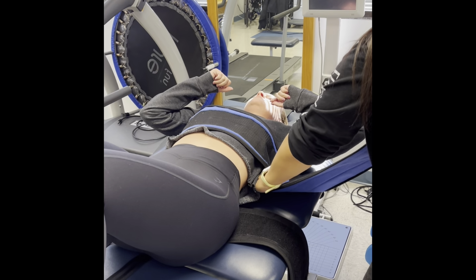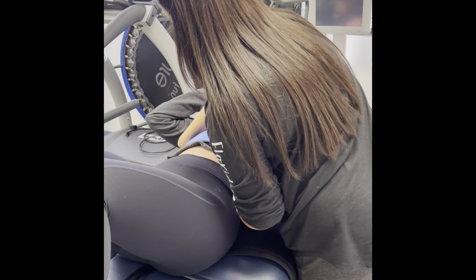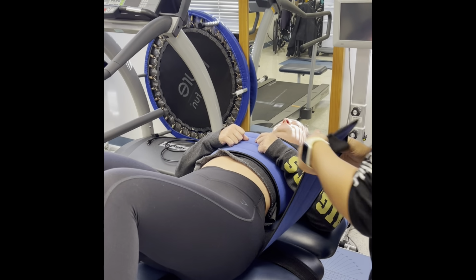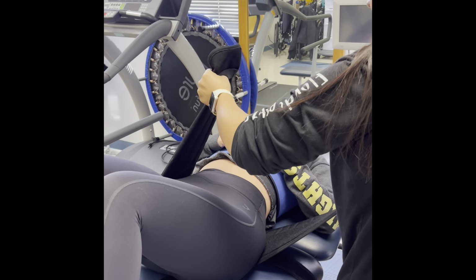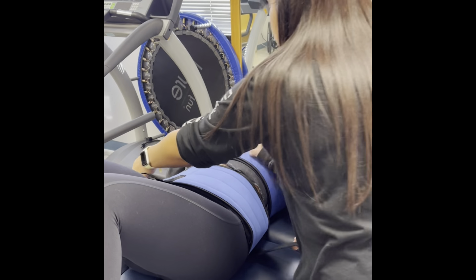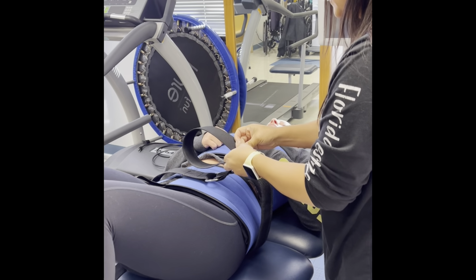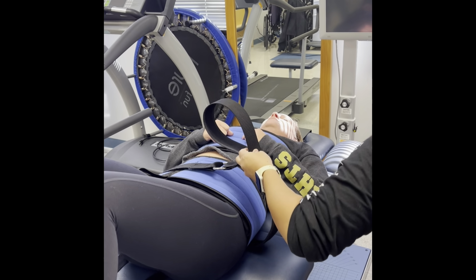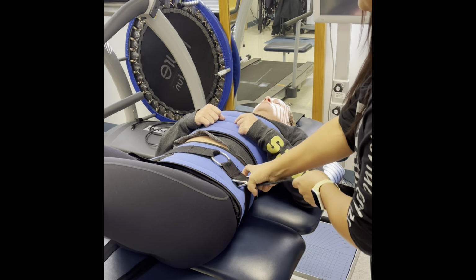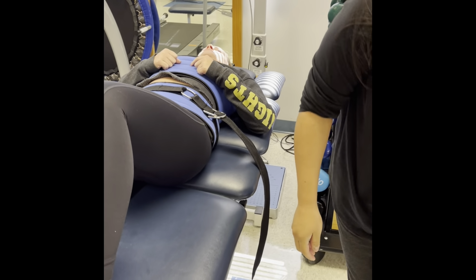All right. Can you breathe in? Give me a good breathe out. How does that feel? Tight. Good. Not painful tight, right? Okay. Do another breathe in and breathe out. How does that feel? Okay. While we do this, we want to make sure that our table is locked and our patient's not moving. How does that feel? Good. All right.